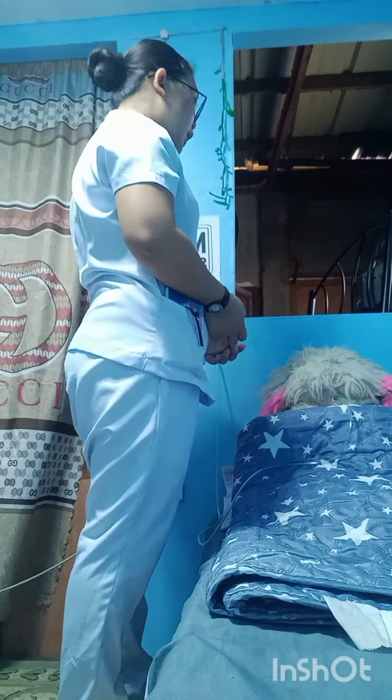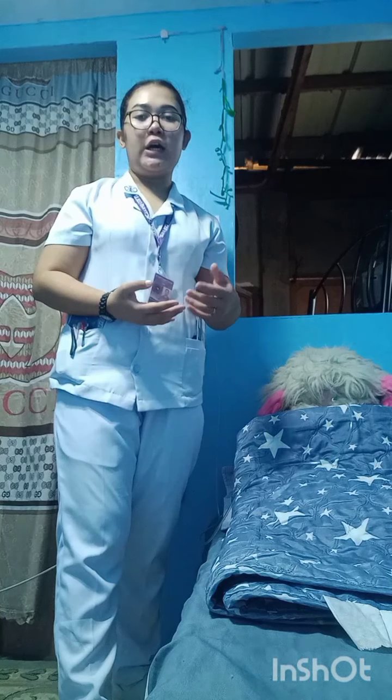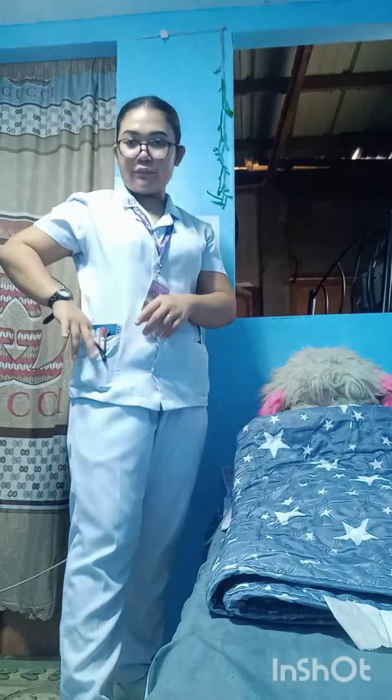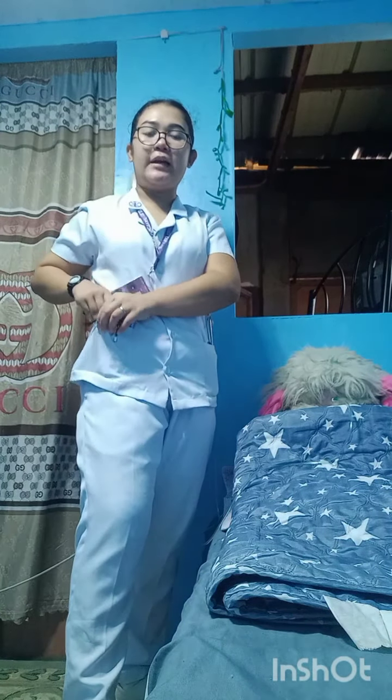Okay lang siya. Also, in vital signs, you can use also pulse oximeter because meron na siyang level of oxygenation as well as the heart rate of the patient. Gaya nito. For the level of oxygenation naman, ang normal level ng oxygenation is around 95 to 100.